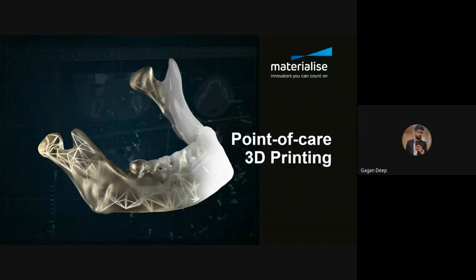Okay, so in the next slide, I'll be talking about 3D POC. What is 3D POC? 3D POC is point of care 3D printing. So in Materialise, we have this concept called 3D point of care, where you can establish a 3D printing lab in the hospital, right?